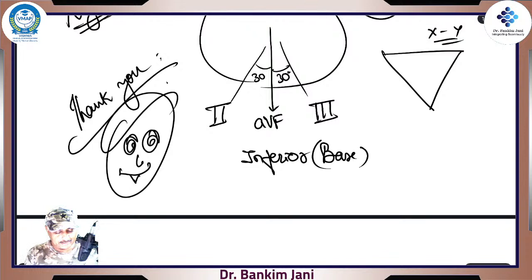Just to revise this, draw these things by yourself also, so that it becomes crystal clear in your mind, because every time we won't be able to go back. When we say there is a basal infarct, straight away watch the AVF, or straight away watch lead 2 or 3. It should come instantly.